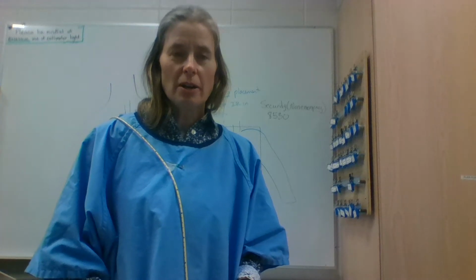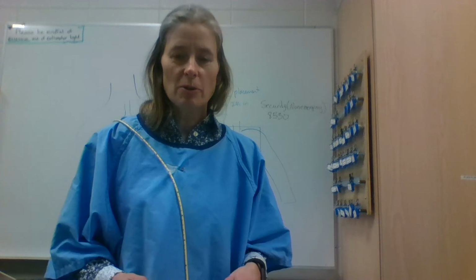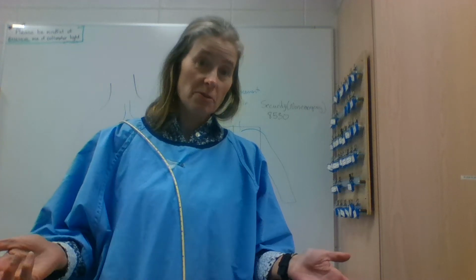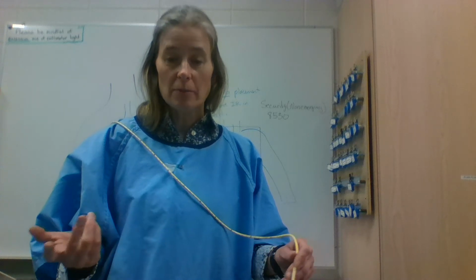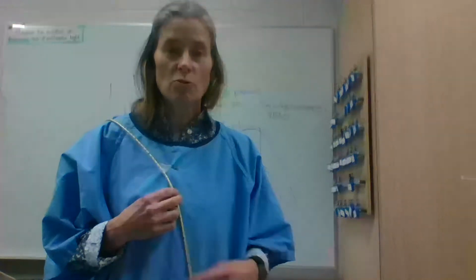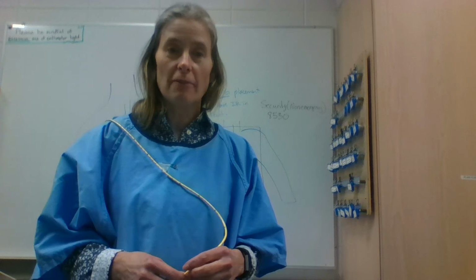Okay, welcome to NG or NE tubes. What we're going to be talking about here today is the three reasons why an NG tube would be used. One of them is decompression, one of them is feeding, and the other one is to provide contrast media orally for a radiographic examination.